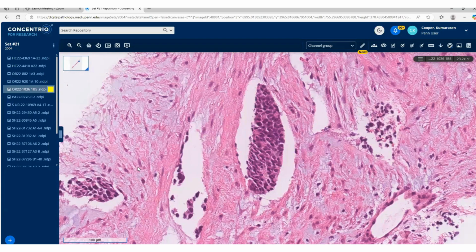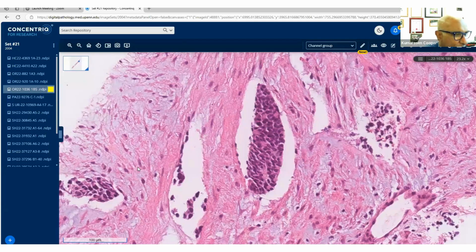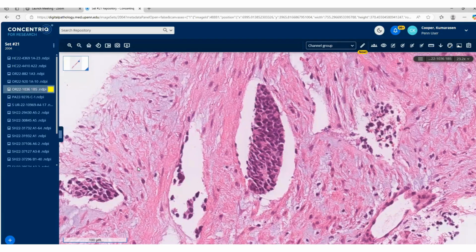IHC profile, doctor. You want an ER, estrogen receptor? Okay, estrogen receptor is negative. Why did you want an ER? Tell us why, please. The first thing that comes to my mind is a hypocellular myxoid tumor with cellular areas. The deep angiomyxoma was my thoughts. Okay, deep angiomyxoma, and you wanted an ER.